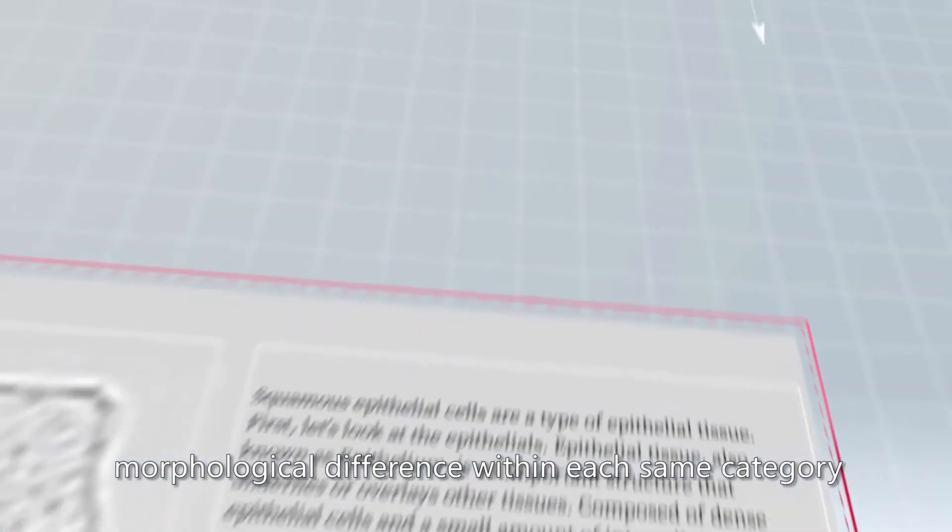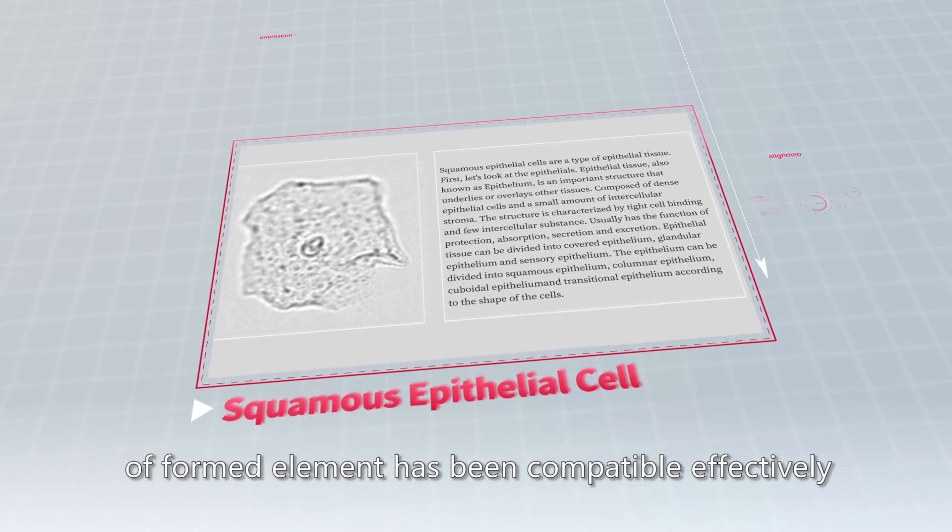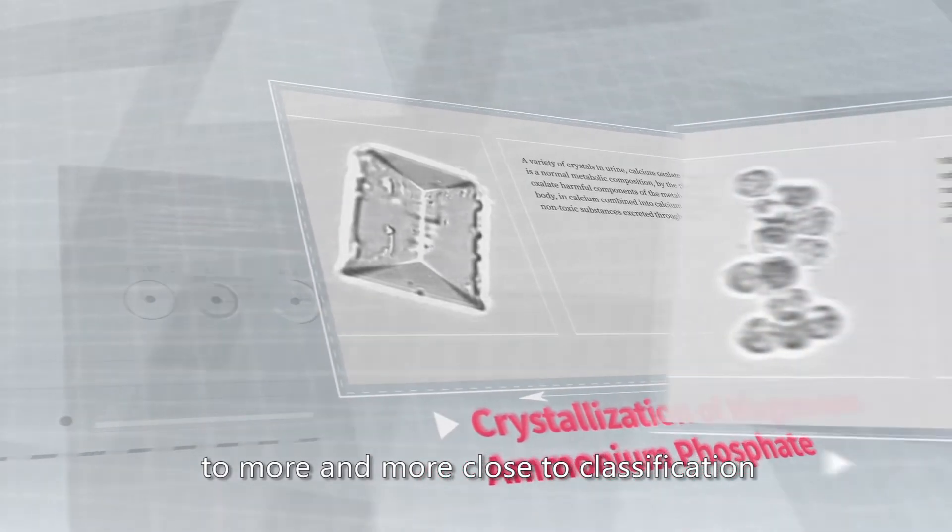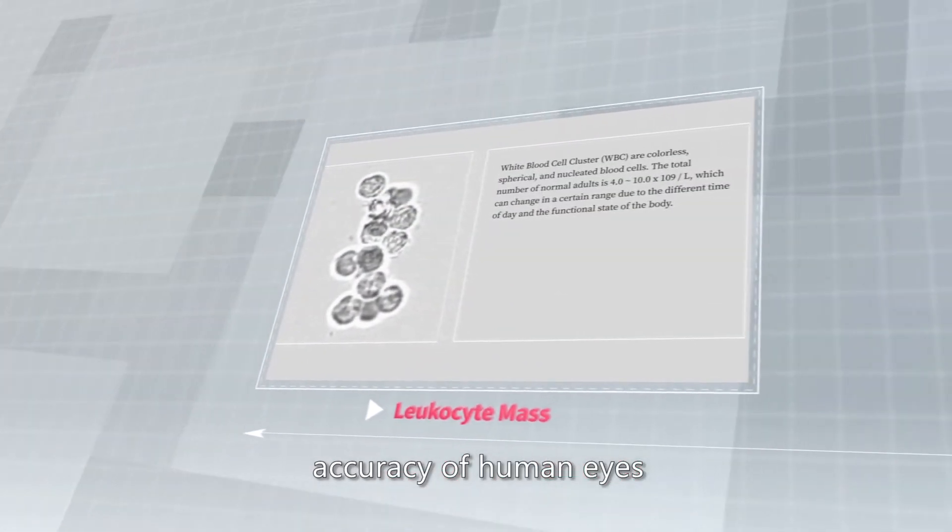Innovatively, morphological differences within each same category of formed element have been effectively accommodated, improving the classification accuracy to more closely approach the classification accuracy of human eyes.